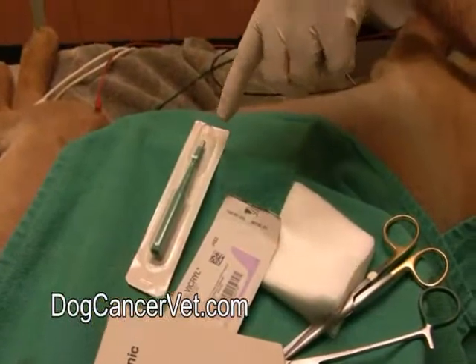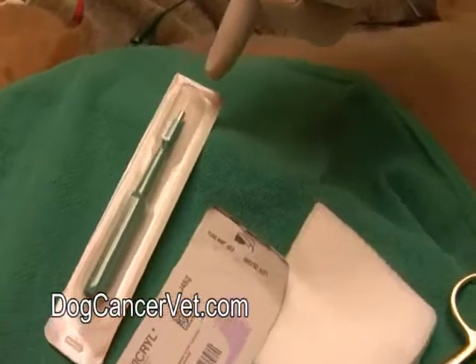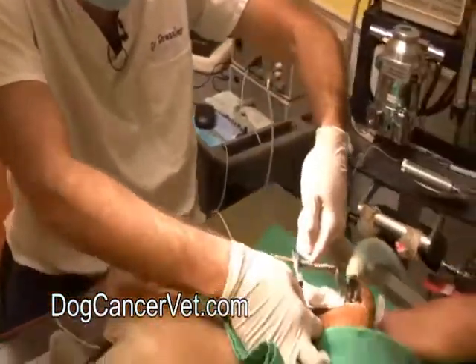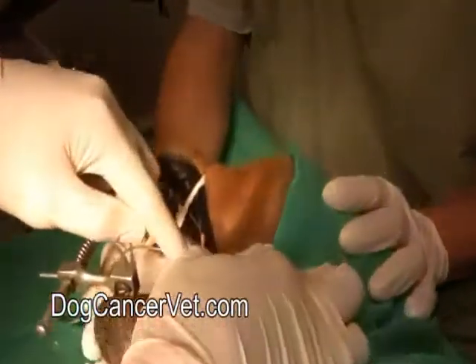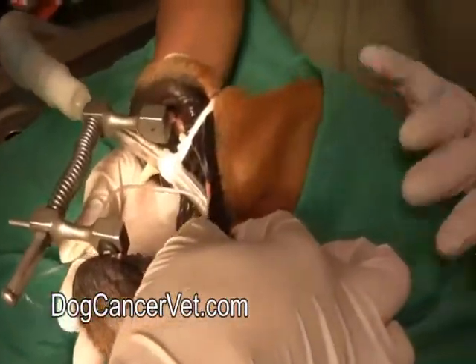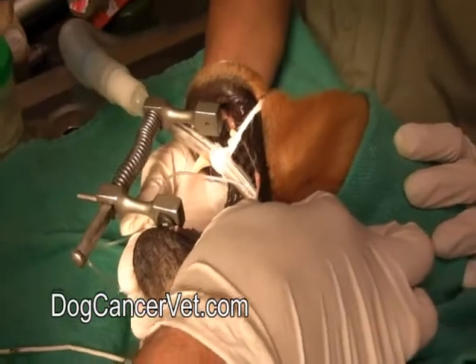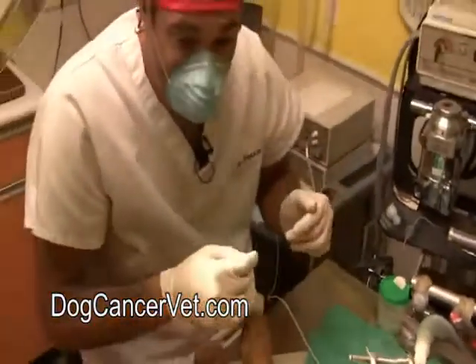When we take our biopsy we're going to literally be taking a little piece of this with this tool right here called a biopsy punch. It's got a little hollow cylinder and the edges of the cylinder on the outside are actually a cutting edge, and what that allows us to do is put it in the affected area and take out like a little cookie cutter - a little circular piece of tumor. Then we're going to put that in some formalin and send it off to the pathologist so we can get some answers, and then we're just going to stitch him up.